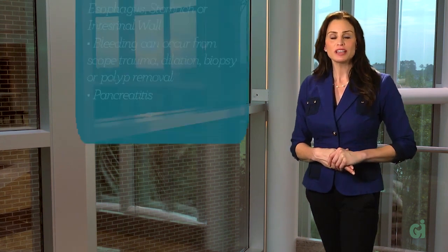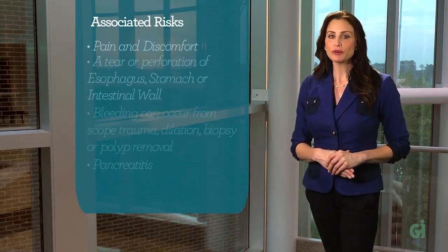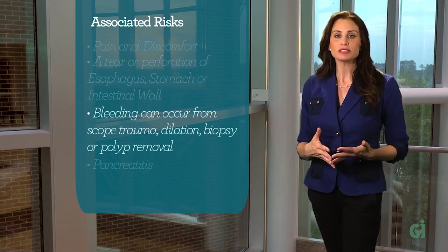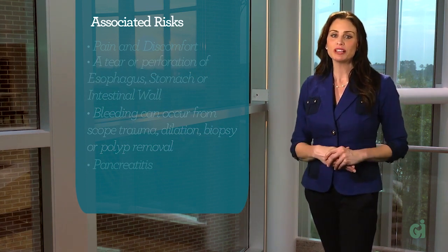ERCP is usually safe and associated with very low risk. However, you should be aware of any possible associated risks. Risks include pain and discomfort, a tear or perforation of the esophagus, stomach, or intestinal wall. Bleeding can occur from scope trauma, dilation, biopsy, or polyp removal.